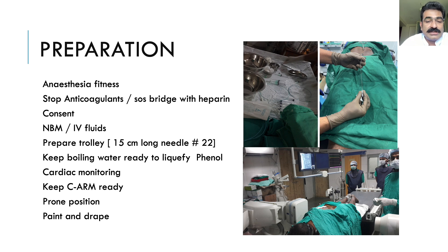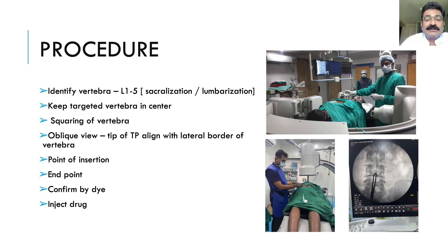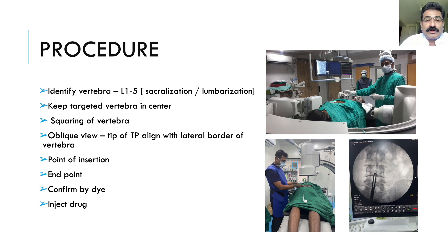The patient is placed in prone position and the lower back is painted and draped. Vertebrae L1 to L5 are identified under C-arm, with attention to sacralization and lumbarization variations. Once L2, L3, and L4 are identified, I usually prefer to perform lumbar sympathotomy at L2 and L4 ipsilateral only, and the targeted vertebrae are marked.